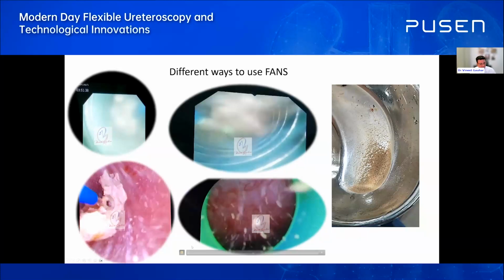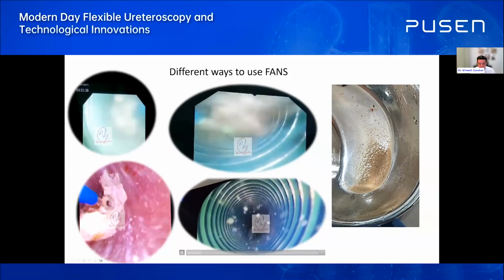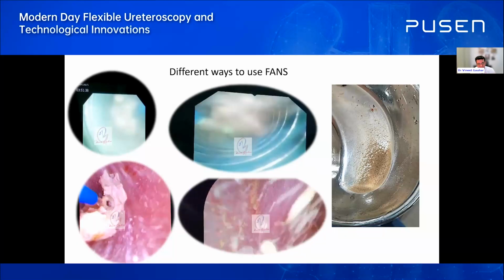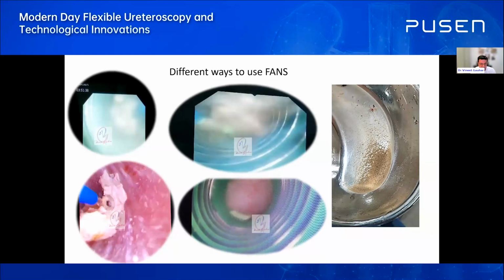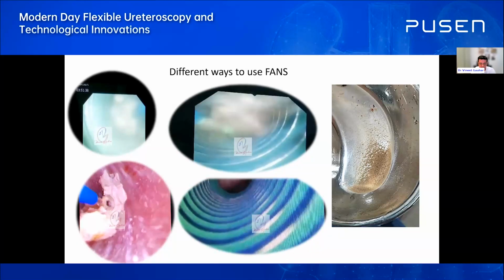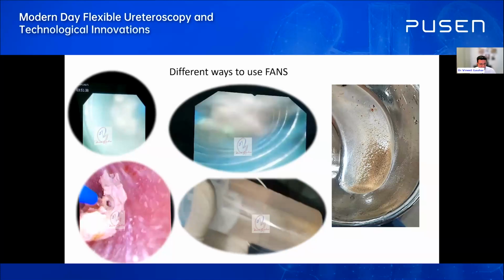The third way is you finish dusting, and I would advise this because you need good irrigation. Finish dusting and then take your sheath to all the parts of the kidney that you want and then aspirate it. You need to have 120 ml of fluid going in per minute, and you need to gauge your pressure for your suction based on starting from the atmospheric pressure and increase it gradually. And don't worry when you have such high irrigation and you're increasing the suction, you're not causing a problem, and I'm just going to show you another video on that.